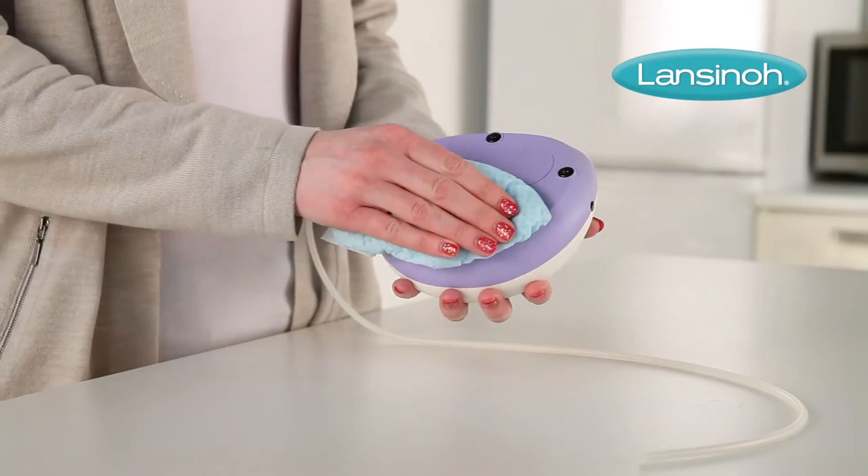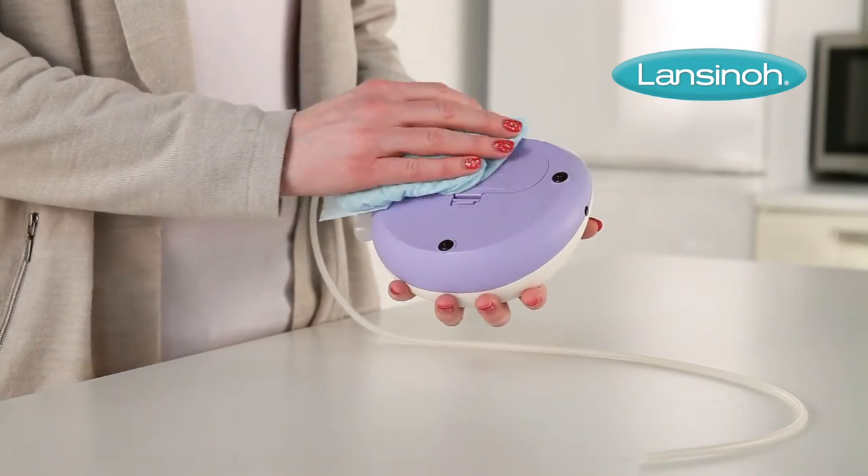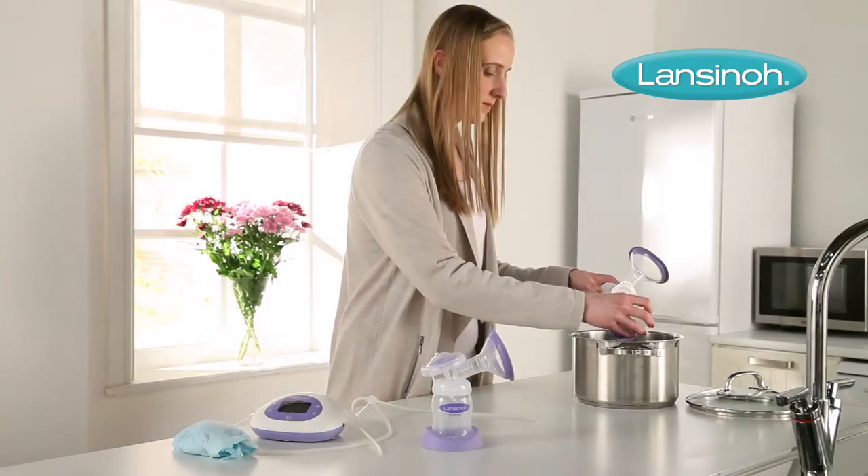To clean the breast pump unit, wipe the base with a damp cloth using only water or mild soap.